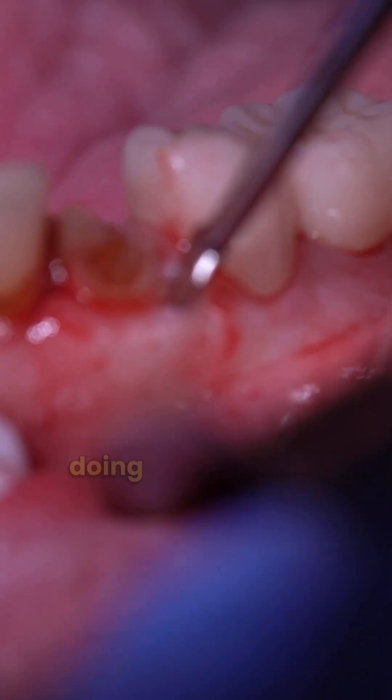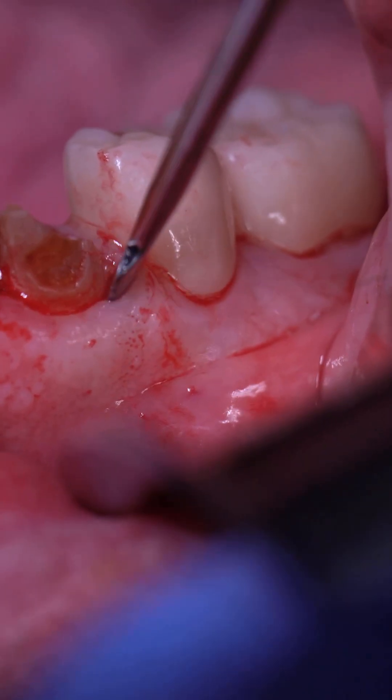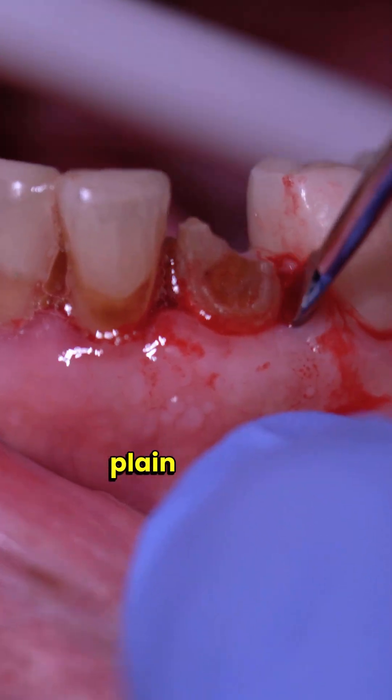In this one I'm going to be doing an extraction and immediate implant placement. Let's go ahead and walk you through this step by step in plain English.